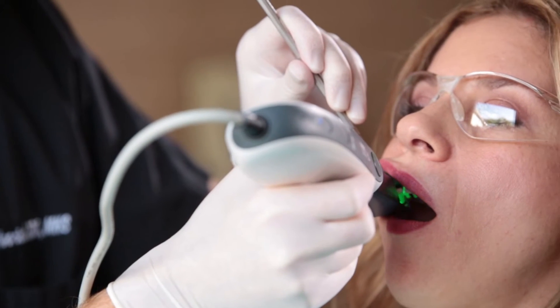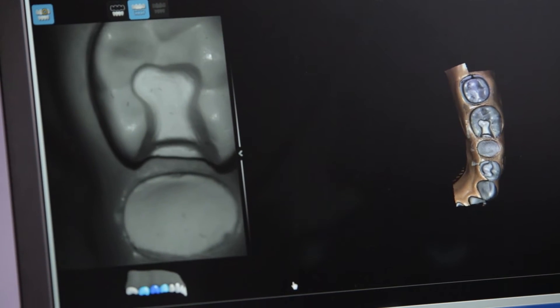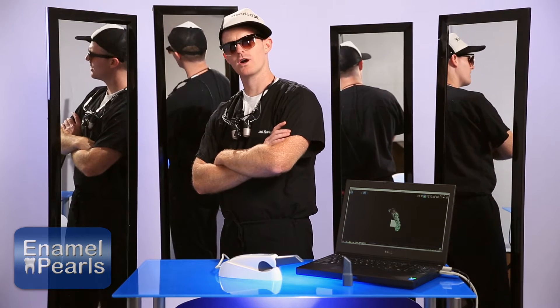Optical scanners work by directing a light beam at an object. The light beam is bounced back to the scanner and the information is digitized. However, shiny surfaces such as metal fillings, gold crowns, brackets, or abutments can blind the scanner, resulting in an overly bright, washed-out area — which isn't particularly helpful when you're trying to create a digital impression.